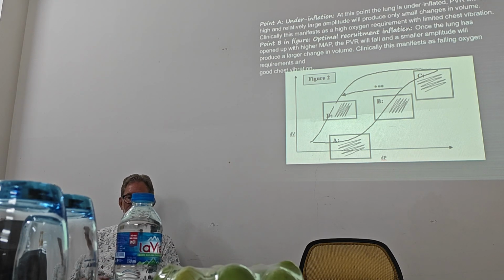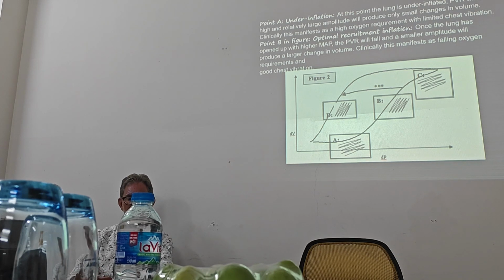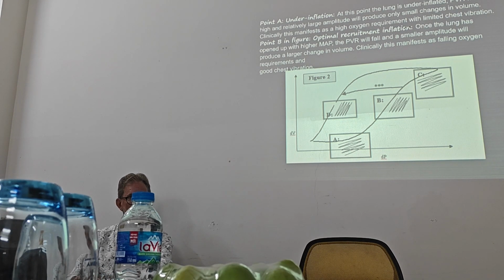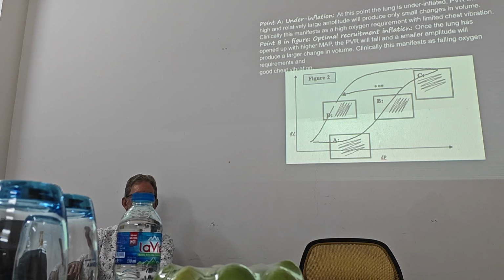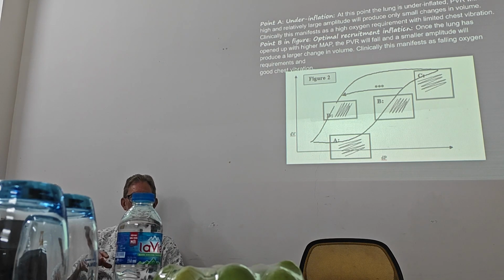So you start the baby on the high frequency ventilation you think will work, and often with recruitment manoeuvre the big problem is oxygenation.